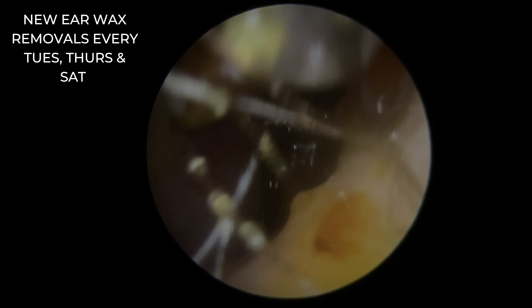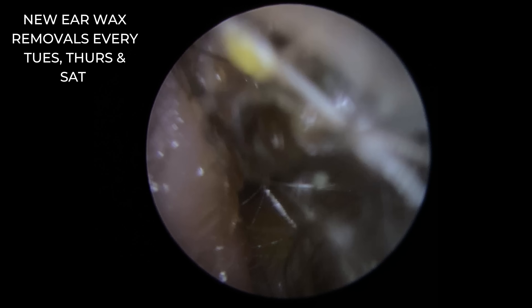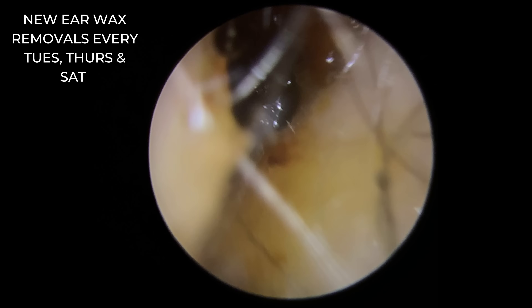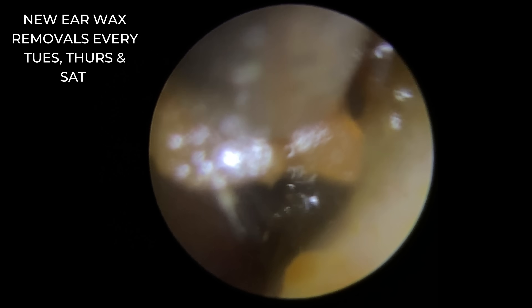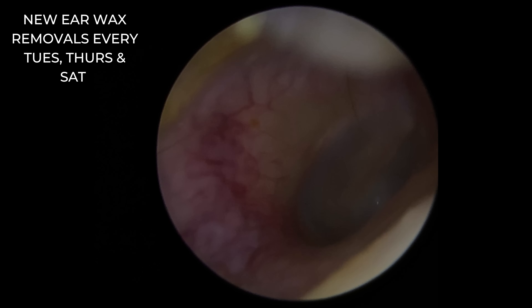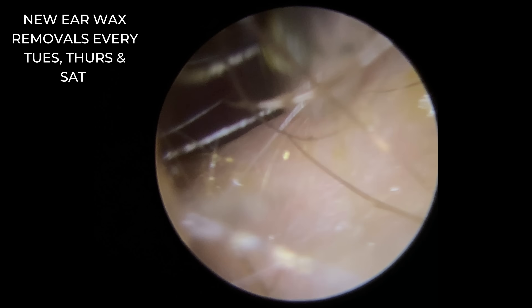Sometimes if patients have over-softened, it can be a little bit more problematic, just because you have to work much closer to that patient's ear canal walls, which can be quite sensitive — especially the deeper in you go. But we're just clearing up and tidying up around the outside edges. All come away very, very nicely. Let's take some of this excess oil away.